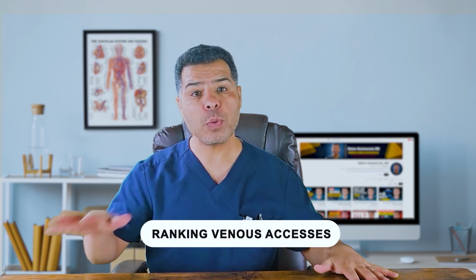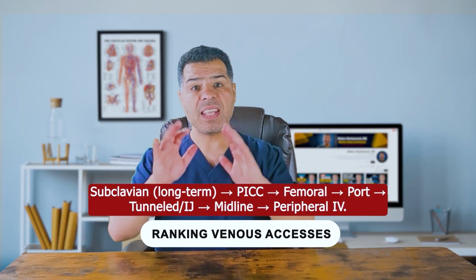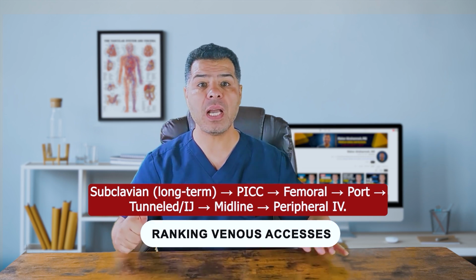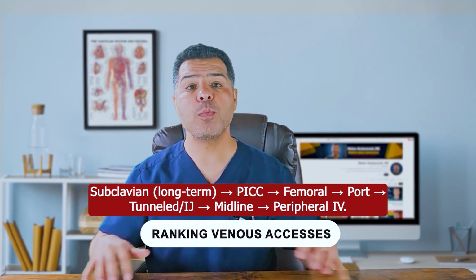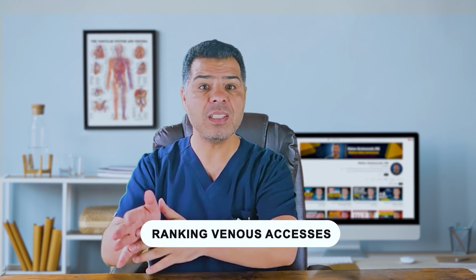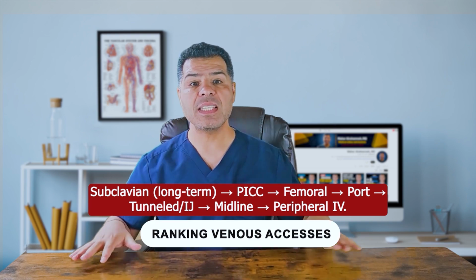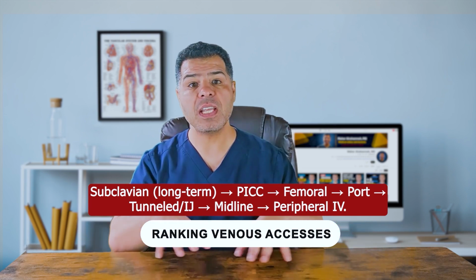How about by thrombosis risk, meaning clot formation? The highest risk is with long-term, not short-term, long-term subclavian lines, followed by PICC lines, then femoral lines, then ports, tunneled catheters, and internal jugular lines, and finally midlines and peripheral IVs carry the lowest risk of thrombosis.